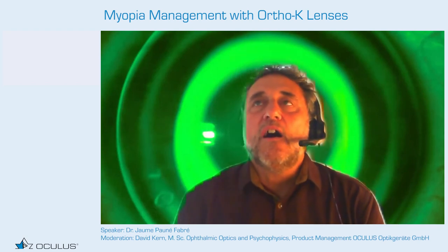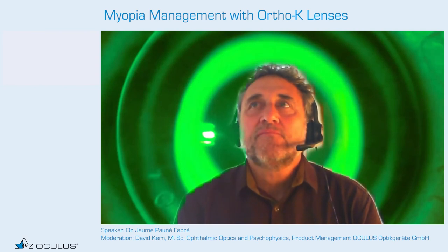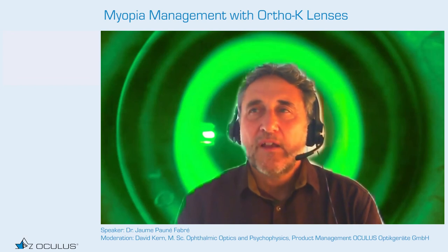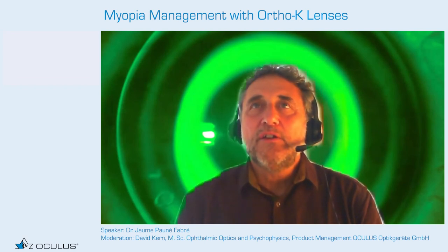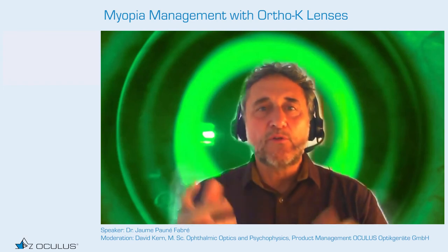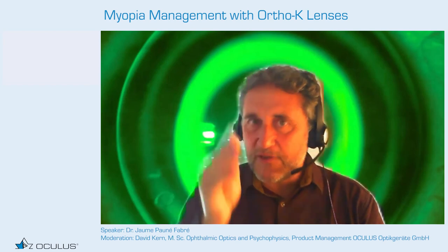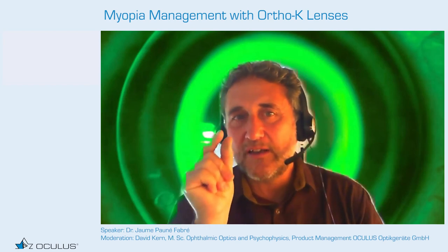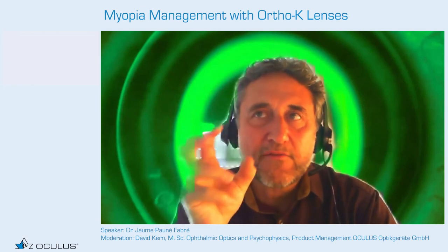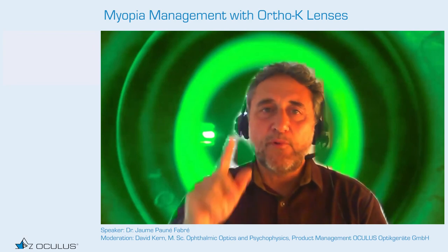And then this is not really clear if you want to measure the power. It's better if you have point to point. The easy way to do it is to click on the point at the center of the ring where you see the most red color, the highest red. This is the mean at the center of the ring. This is the point to click.